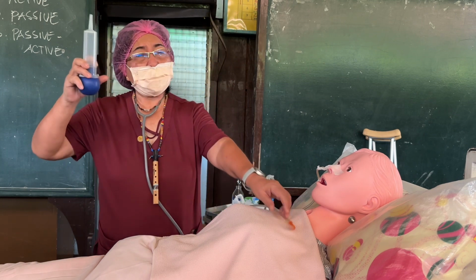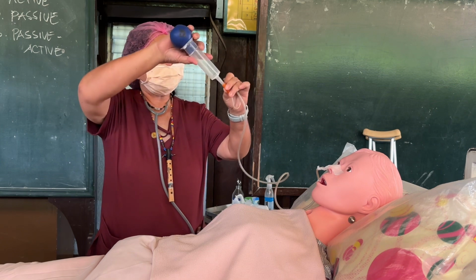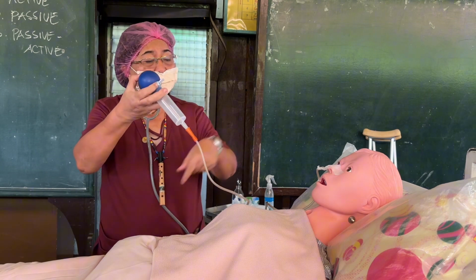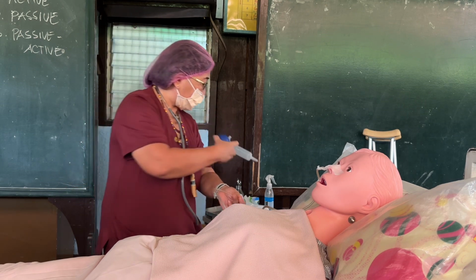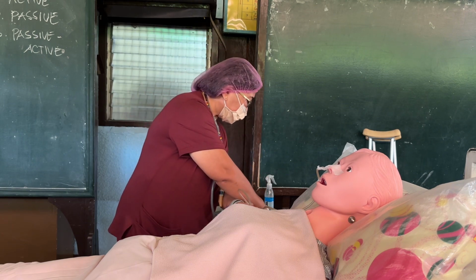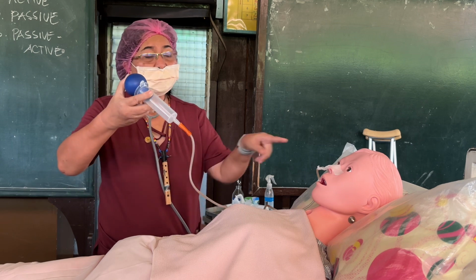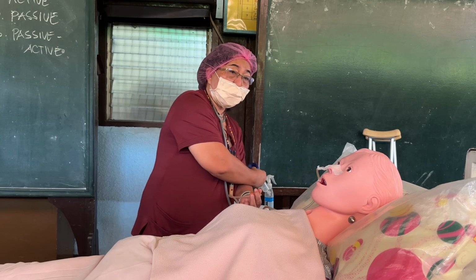Then I unkink and put the tip of the syringe open. Then I press it: the PNSS goes in. When I release, the gastric contents come up. I put them in the receptacle. Then aspirate again with new PNSS. Introduce, press, it goes in. Release, it comes up. Repeat until you finish the 1,000 cc.